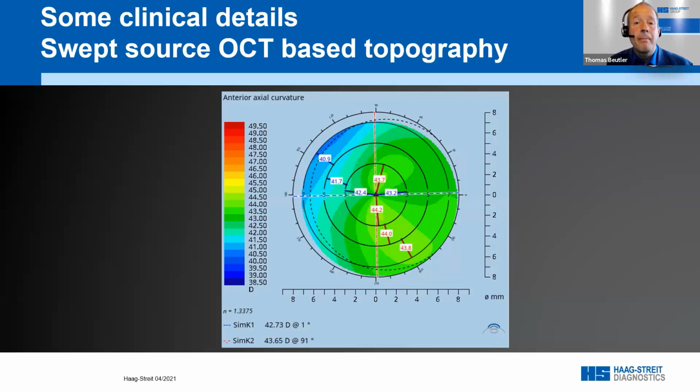So there might be a good chance that at least for day vision, a toric could help. We see on the intermediate and on the peripheral zones that there the asymmetry is prominent, and therefore only a steep and a flat axis are on display and not two steep and two flat ones, because there's basically just a steep and flat area.